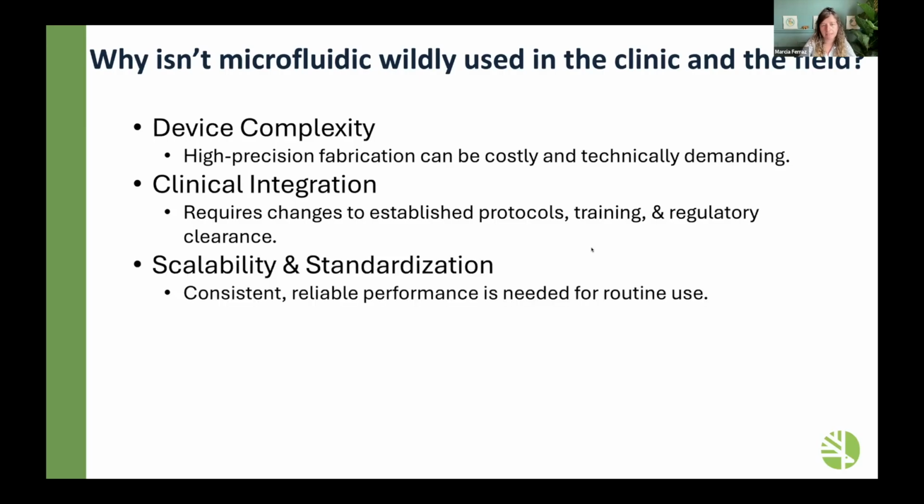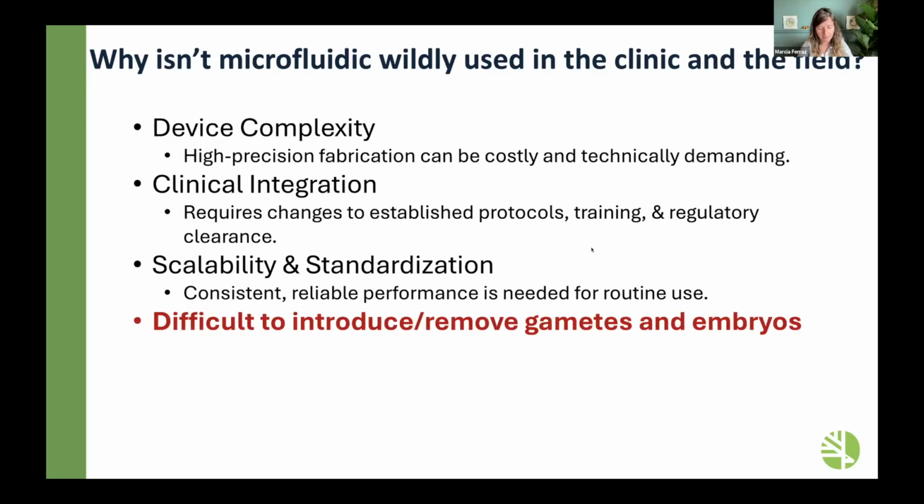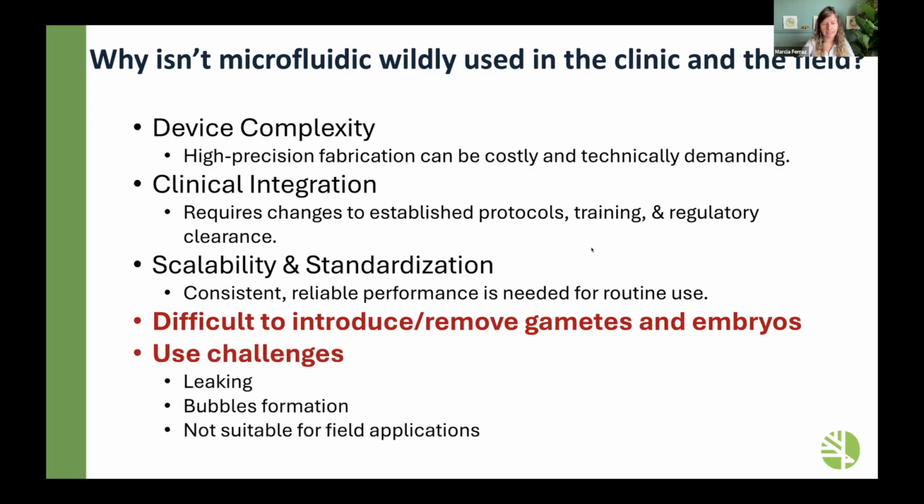Of course, there are scalability and standardization. It needs to be consistent, and reliable performance is needed for routine use. So far, we don't have that. But for me, the most important thing, which is what I'm going to talk about now, is that it's difficult to introduce or remove gametes in those devices. You need practice for that. And there are also some challenges in use, like leaking and bubble formation, so they are not suitable for field applications. You need a pump or whatever it is in there.